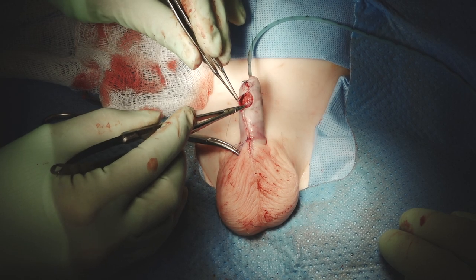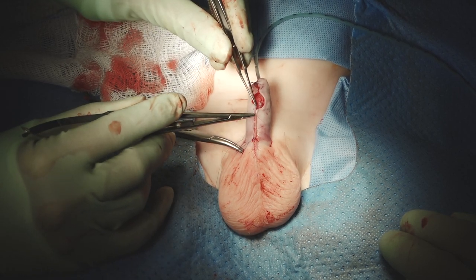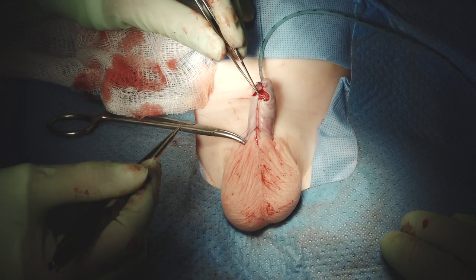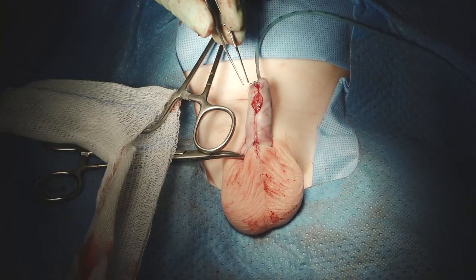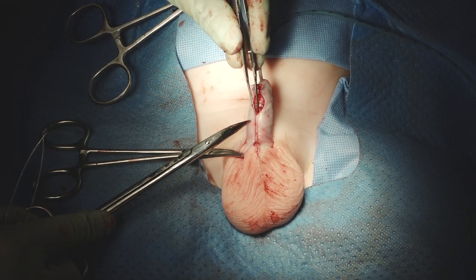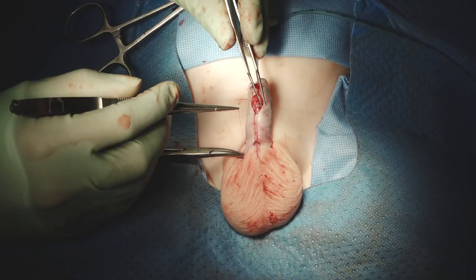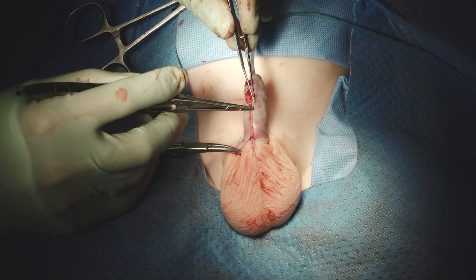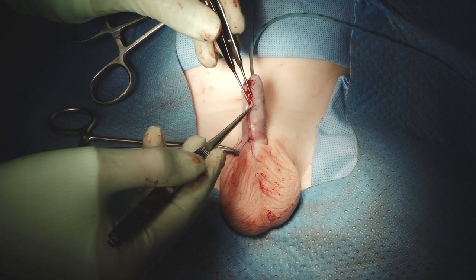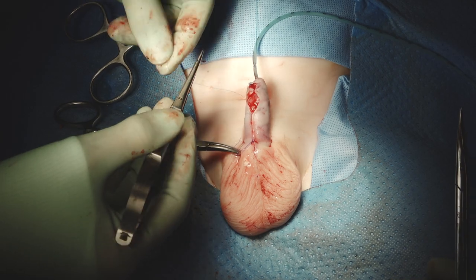The next boys you operate on: at the very beginning of the case, look and see if the penis-scrotal junction is symmetric on both sides, because it often is not. If it's higher on the left, you have a left penile skin deficiency. It's almost always on the left. If we try to pull that up, it's just too tight. All of this is skin flap that we've wrapped around — it's close to symmetric on this side, but just a little bit higher on the right than the left. If the penile torsion hadn't resolved when we cut the urethral plate, we would need to address it at this juncture too, using a dartos flap wrapped from the dorsal surface cross-midline to the left side to rotate clockwise.